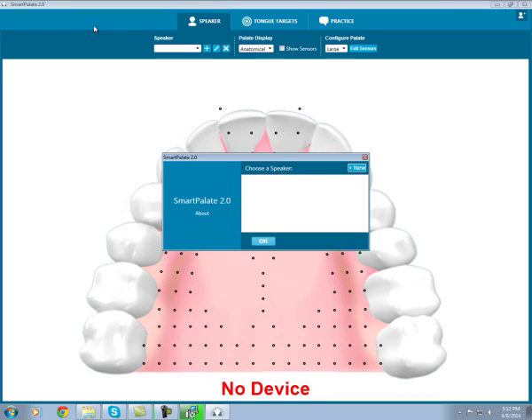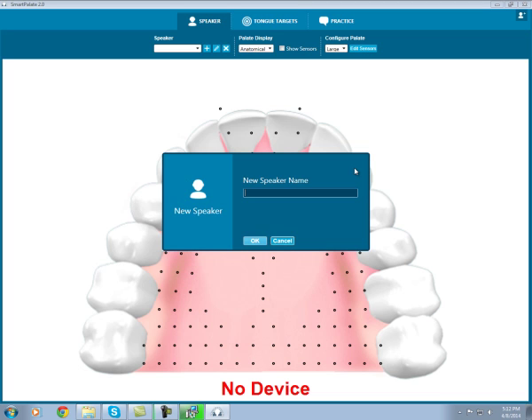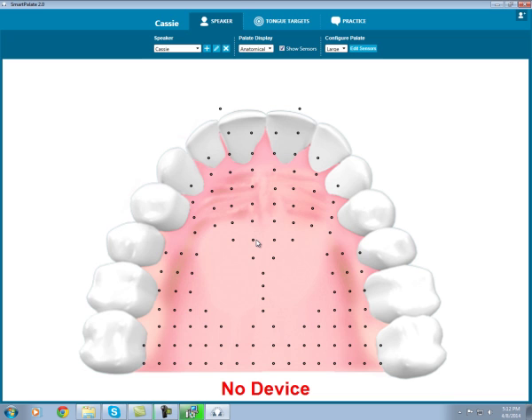Here you will be given the option to create a new speaker. In the future, you would also be able to select any speakers you have previously saved in a list that would appear here. The speaker file allows you to save the display preferences and configuration for each person who uses the software. It will also allow you to save recordings and custom targets for each person. We'll take a look at each of those features later on.